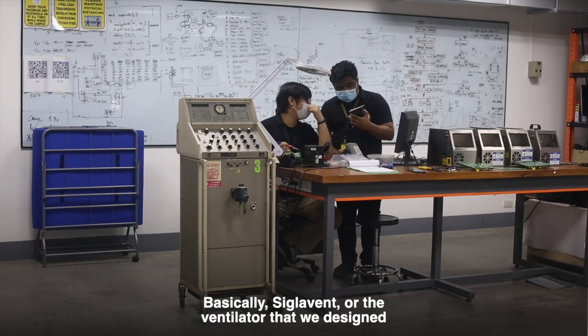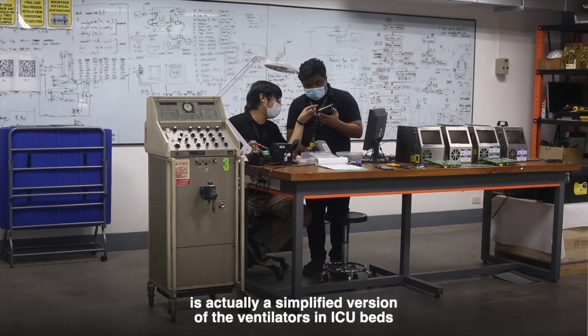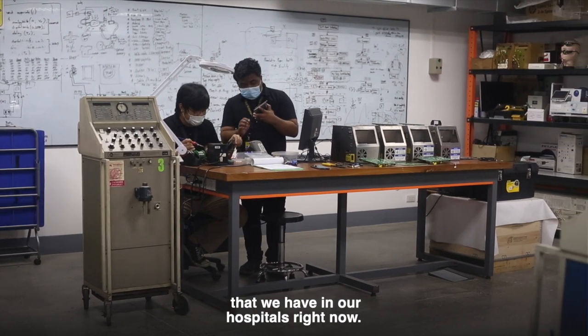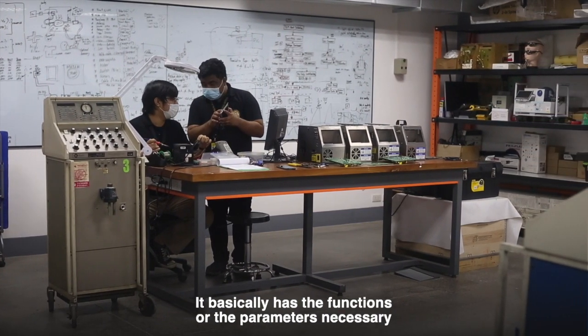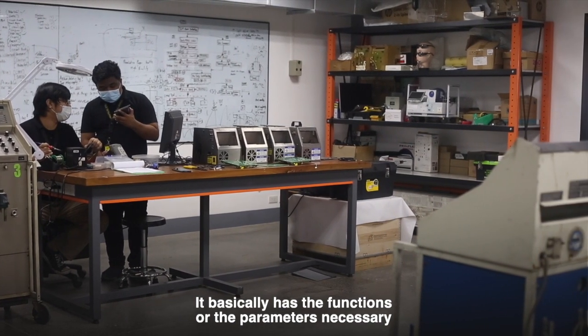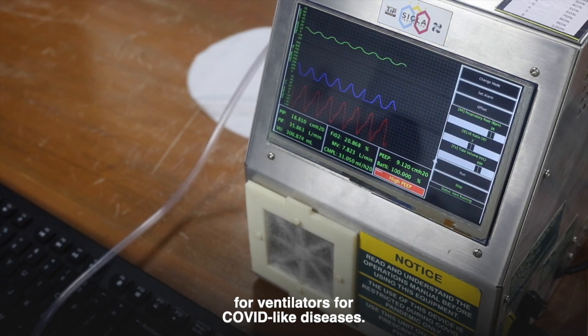Basically, the ventilator that we designed is actually a simplified version of the ICU ventilators we have in our hospitals right now. It has the functions and parameters that a ventilator necessarily should have for COVID-like diseases.